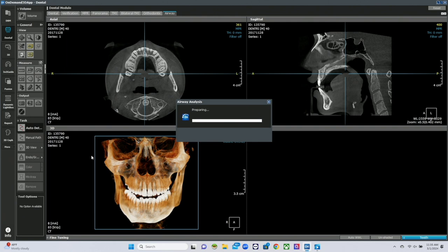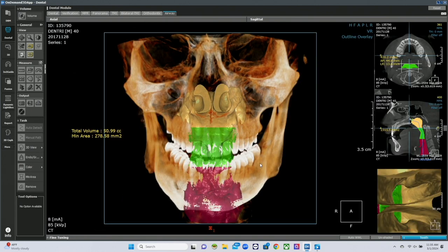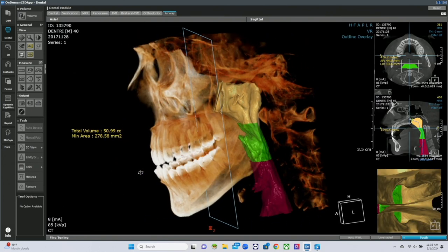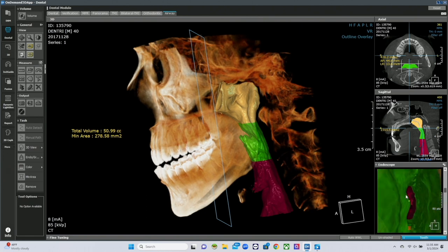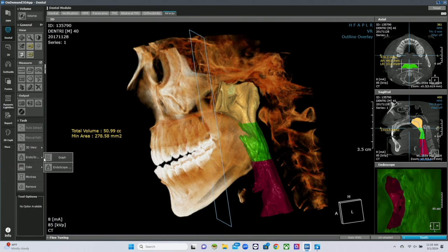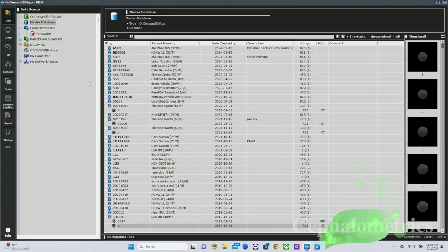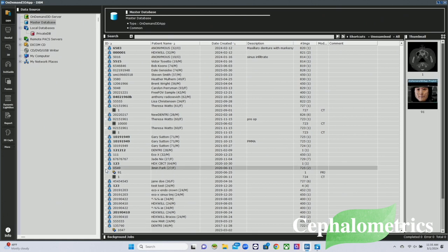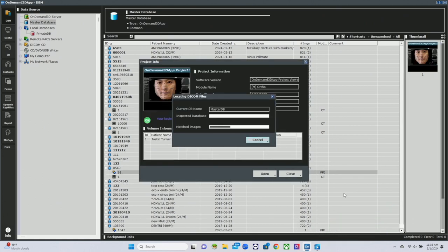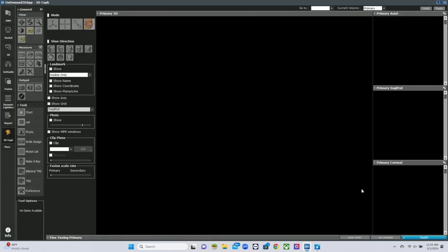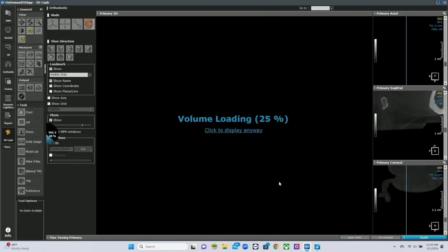We can automatically detect the airway and do volumetrics on it. If you're doing sleep apnea or airway treatments, you can get volumetrics on the airway, assess it, and it will create a graphical representation of the airway for your documentation. Finally, you can also do cephalometrics through the CBCT — going through with a 3D image and performing cephalometric analysis.